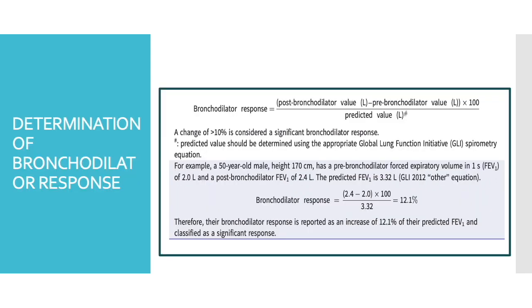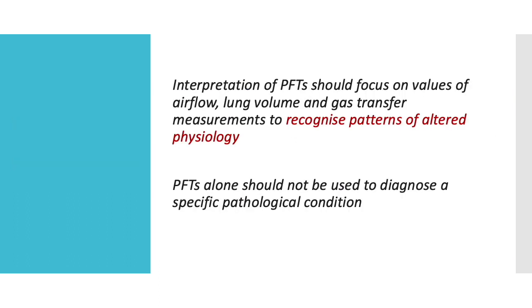One important change that we spoke about in the last video was the determination of bronchodilator response, and we'll be applying it to understand how it has changed. Basically, the interpretation of PFT focuses on these values and these deviations, and they recognize these patterns of altered physiology.